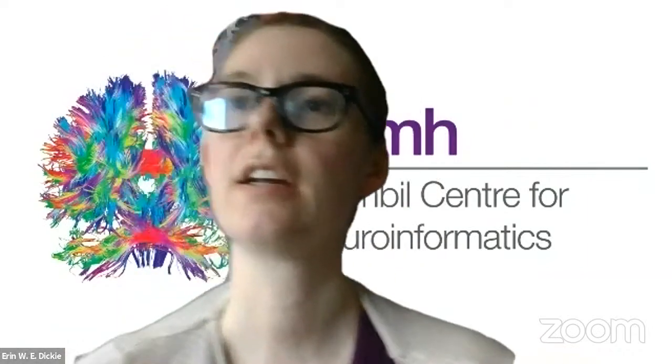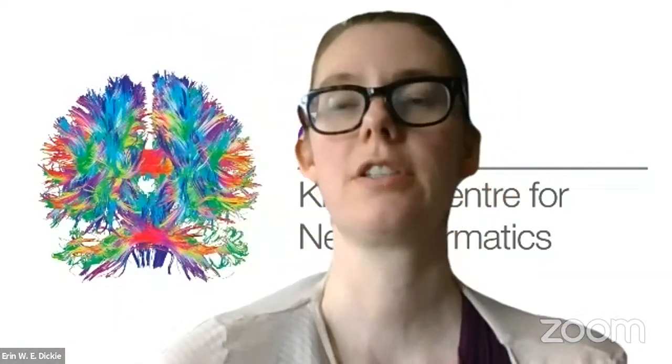Okay, and move this over. Cool. Okay. So in here, we're going to go to the BIDS Starter Kit. And in the BIDS Starter Kit, I just wanted to show you part 1A, which is the introductory walkthrough. Because I think going through this, I recommend, if it's not coming through quite as easily, that you can try to do it at home. You should be able to do all of this at home.